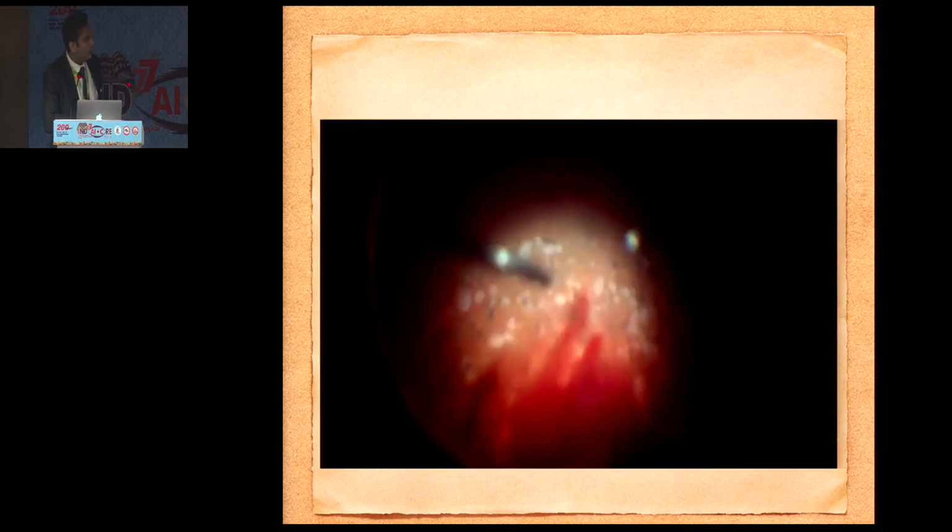Previously, with nasal traction and lateral vitreous bleed, we would have observed and lasered more. But these days we go inside because the recurrent bleeds are because of this proliferation. We remove the nasal traction. We have to be a little gentle. Like in this case, it was a little rough pull and there was a break created nasally. But then we realized it early. We did not extend that break.